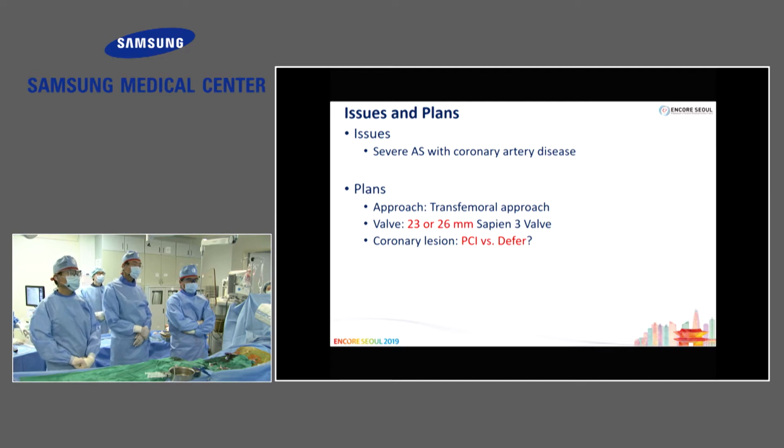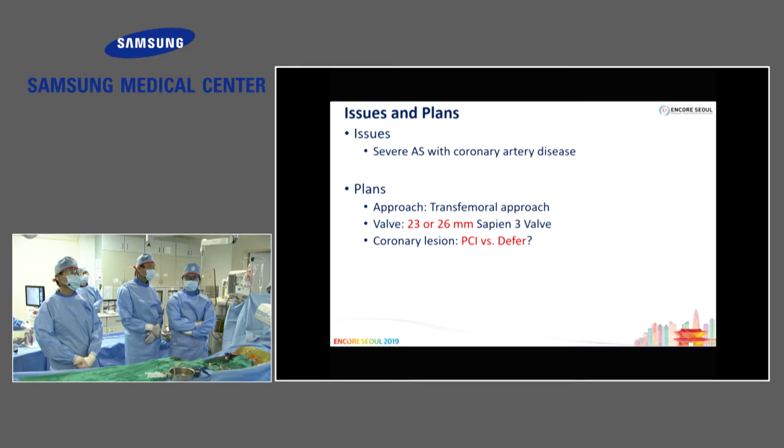Yeah, Dr. Gwon, this is Ramesh Dagubati. I think this is a really good case. I would have done an FFR-guided PCI of the LAD at the same time as the circumflex, because the LAD also has slow flow, or even without FFR you could do it. And I think my valve would be 26 minus probably 2 ml, and that's pretty much it. Dr. Che, what do you think?